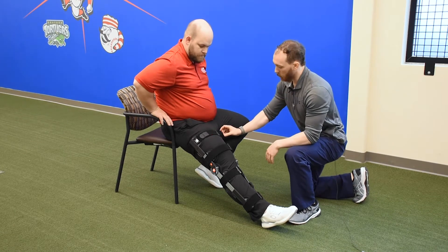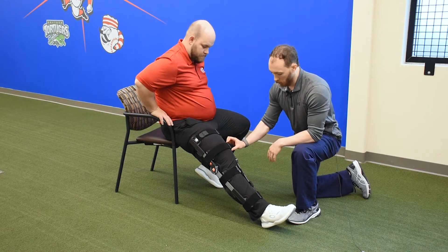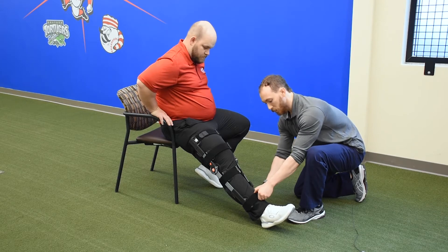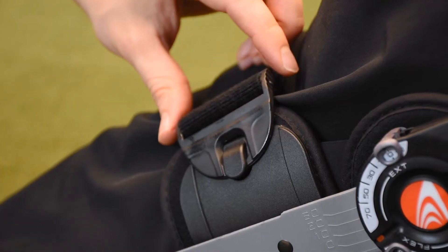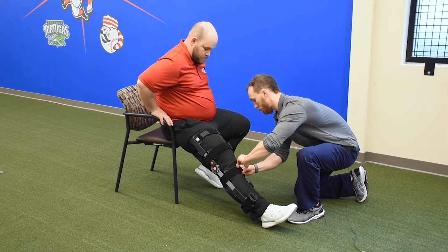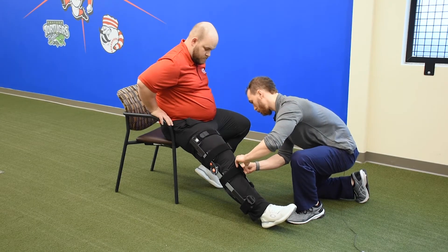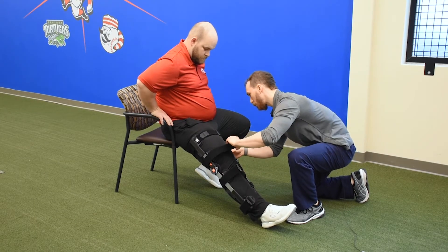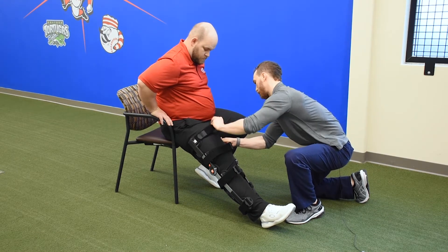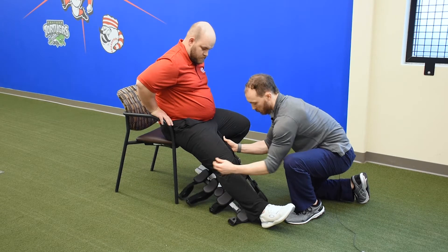We start with four hook closure clips. What we do is slide these toward us and down, and they hook out. Then the knee brace comes right off.